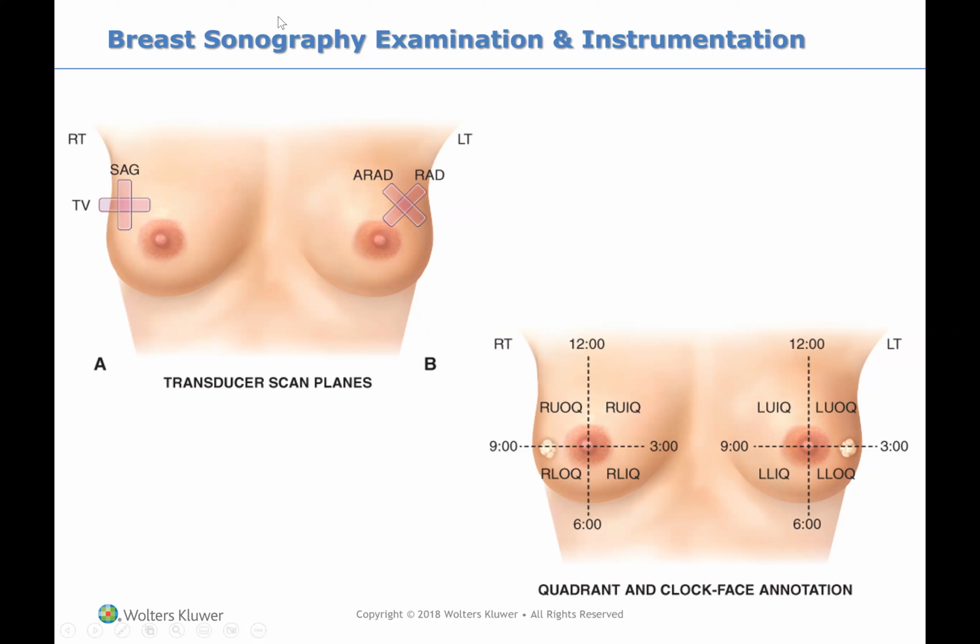And then the other thing that you do is we do rad and anti-rad, not sagittal and transverse. The difference is radial is like the sun, basically. It's like a clock, the hand is going around like a clock, and that's radial. And anti-radial is the opposite of radial, basically. So you're looking at it more in an array than sagittal and transverse.